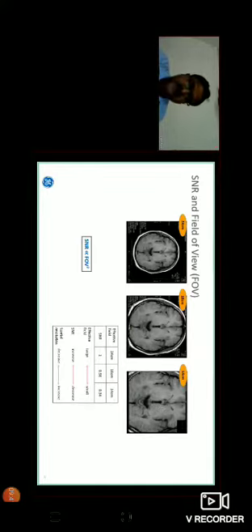And it is a simple thing. If you want to increase your spatial resolution, you can just reduce your FOV. Keep an eye on your SNR also. It should not be reduced. Okay, so what will happen if you change your FOV? With a small FOV, the voxel volume is less, as I told earlier, and with a larger FOV, the voxel volume is larger, can accommodate more number of protons. So yes and no.